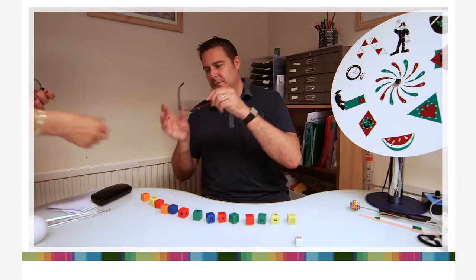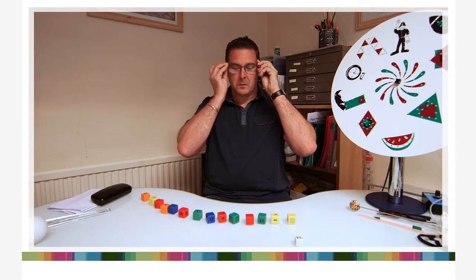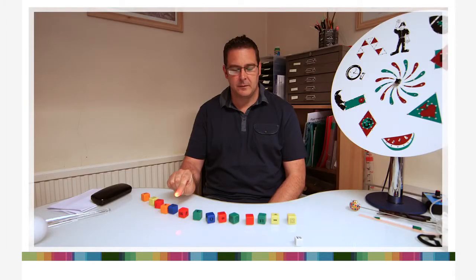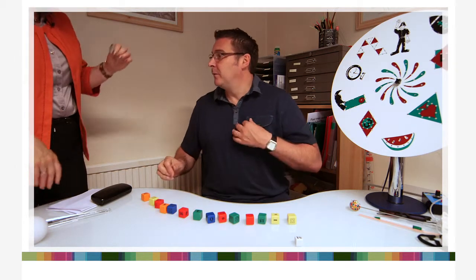There. Okay. The green one. Okay. And if you pop your glasses on, fix on him again. Yep. Yeah. Big difference, isn't it? Yeah. Massive difference. Let's put the extra prism on. Okay. Watch the M again.